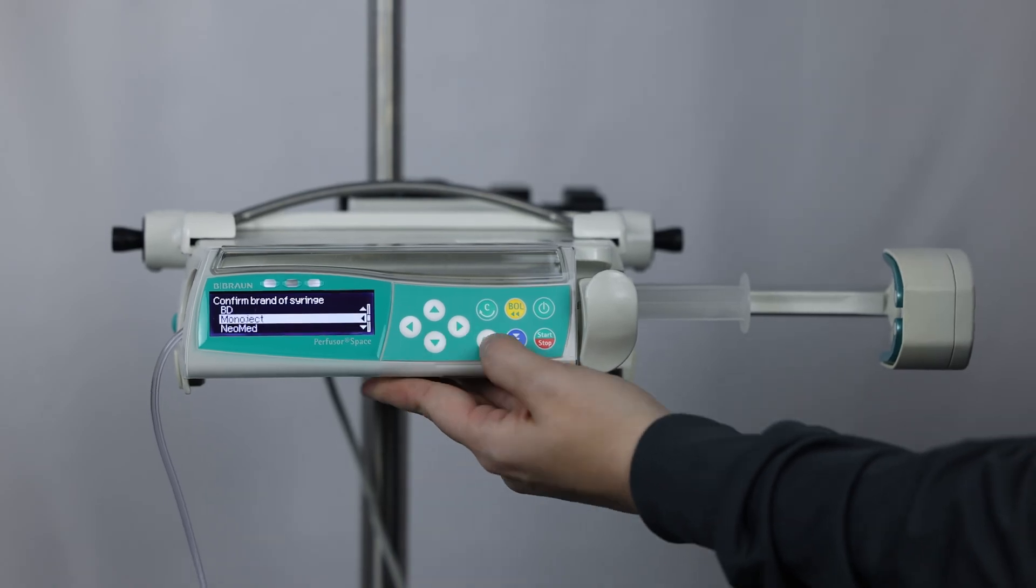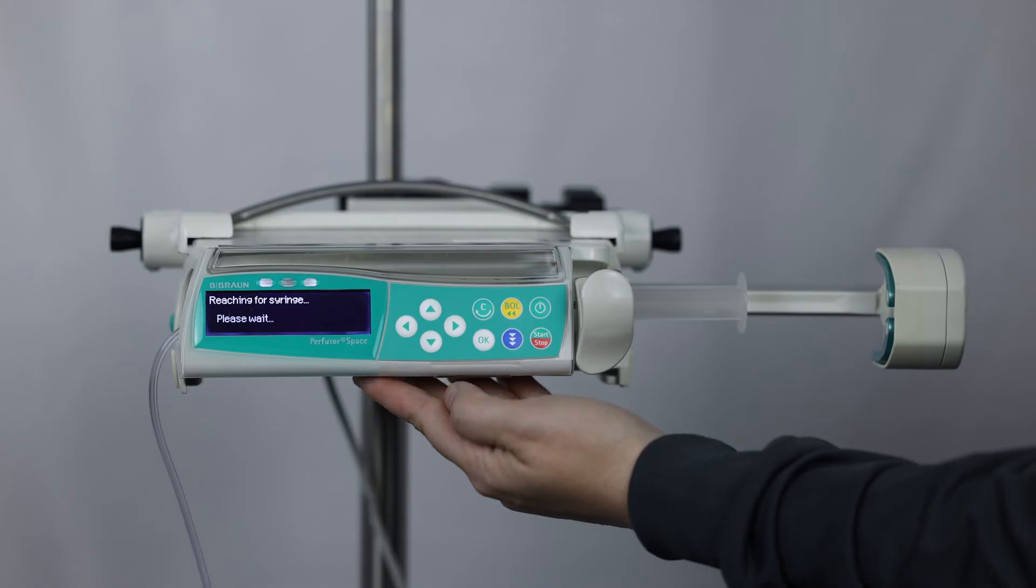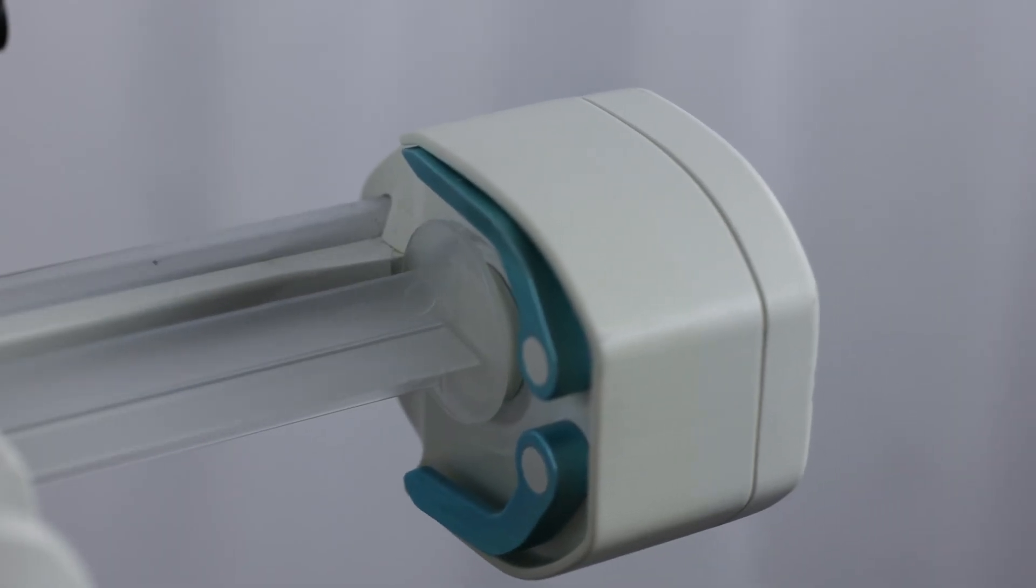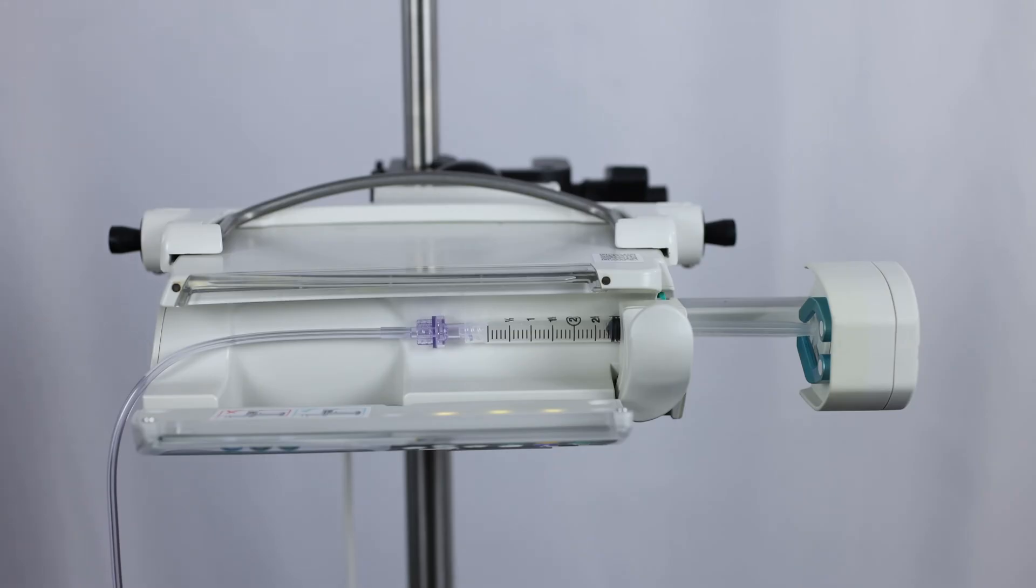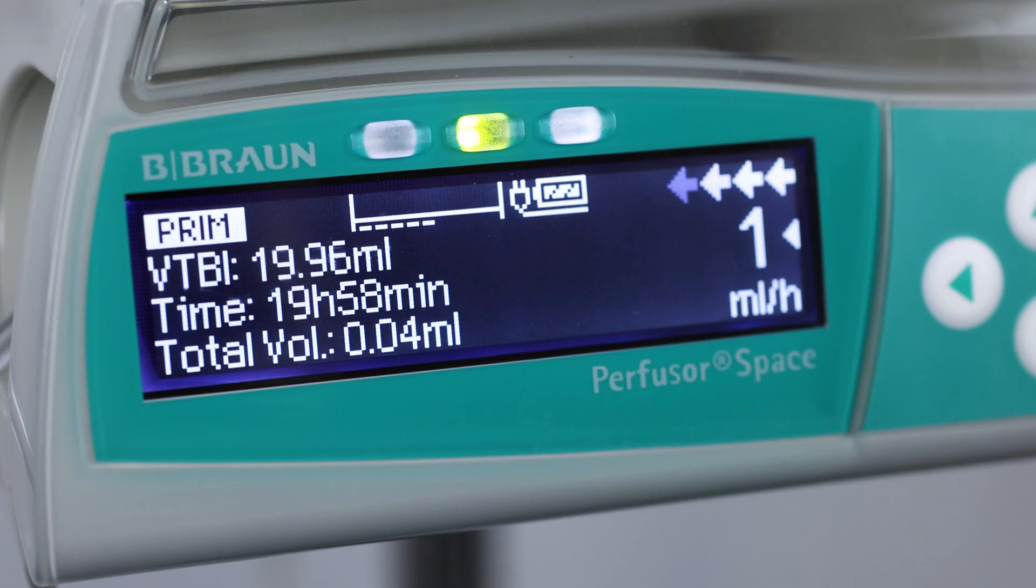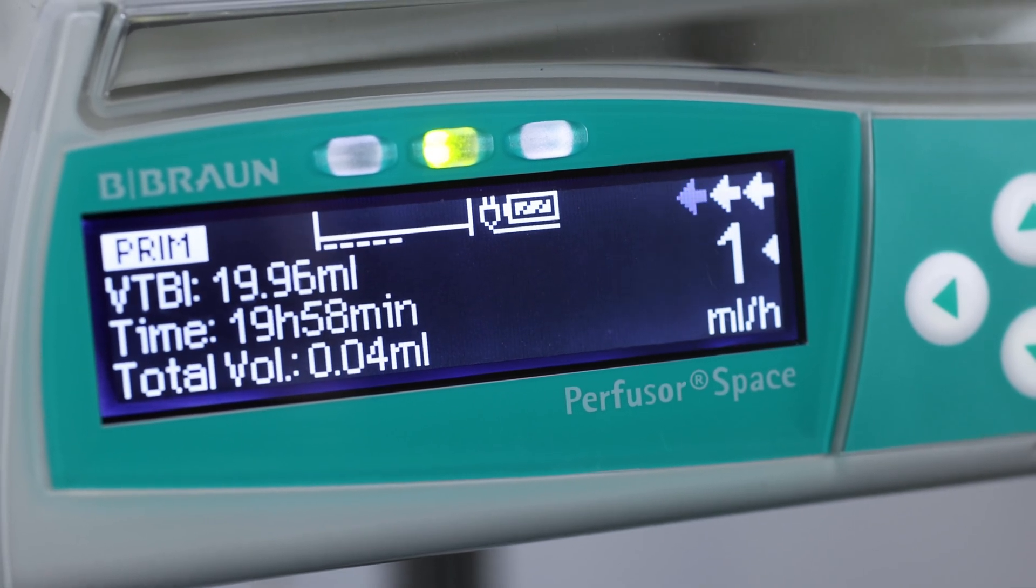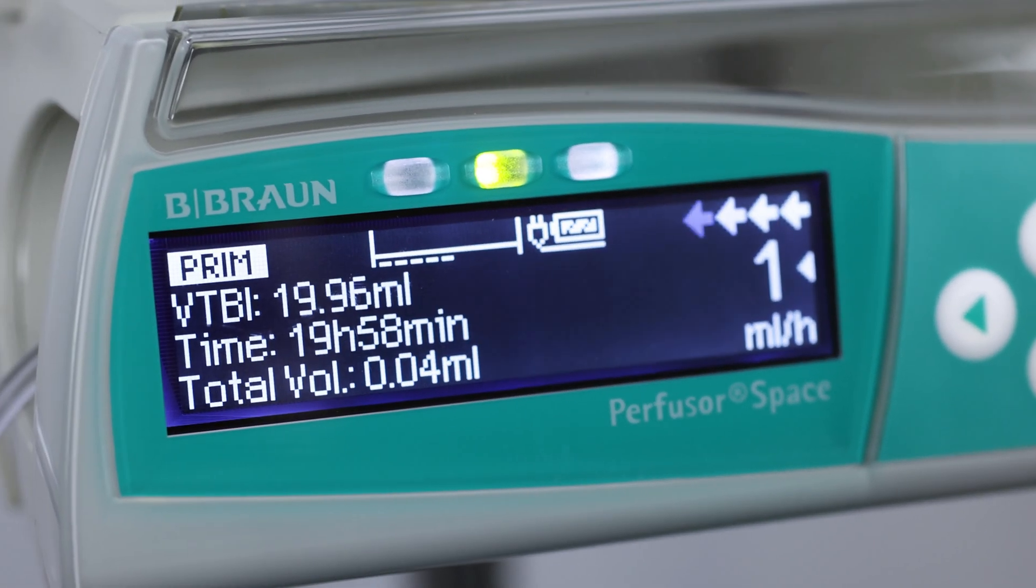Syringes manufactured by BD, Terumo, Monoject, and B. Braun are all compatible with this syringe pump. Luer lock connector syringes, varying from 1 milliliter to 60 milliliters, can all be used with the B. Braun Perfuser Space. The flow rate range for the B. Braun Perfuser pump is 0.01 to 999 milliliters per hour.